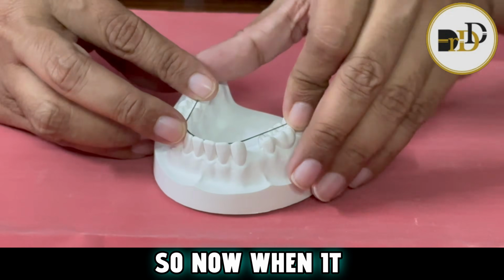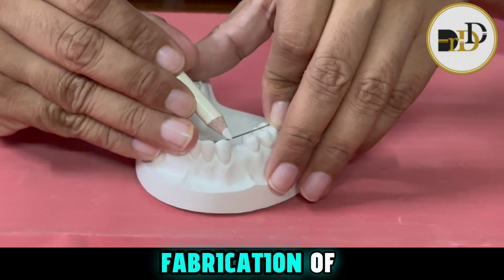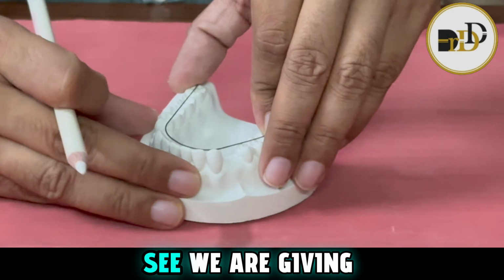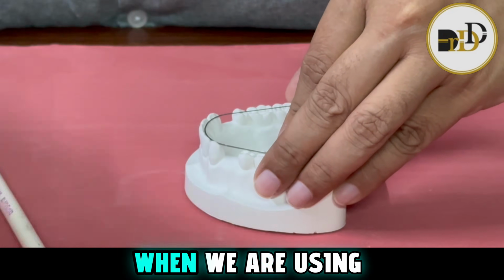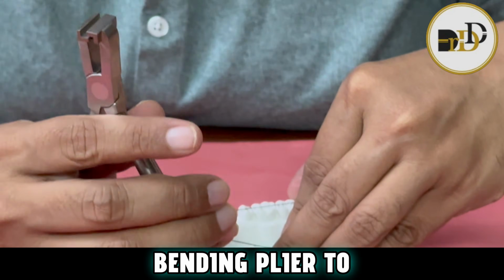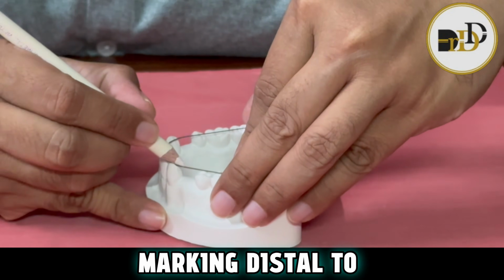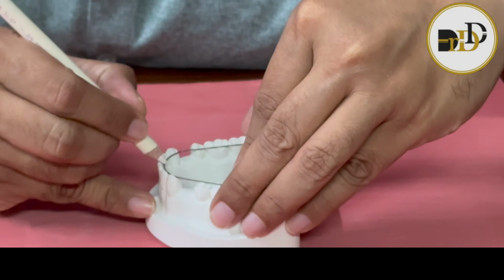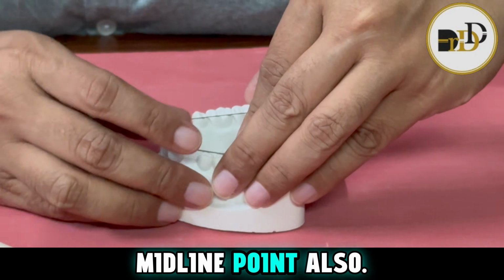Now, when it comes to the fabrication of the bends, we give the bend using the lingual offset bending plier. I am giving the marking distal to the canine and at the midline point also.